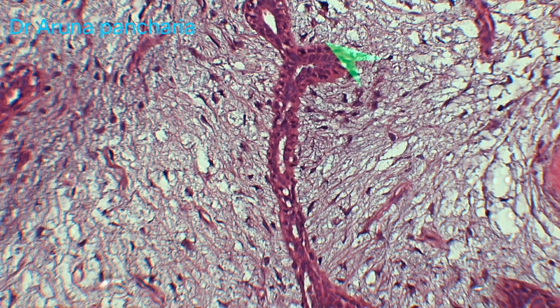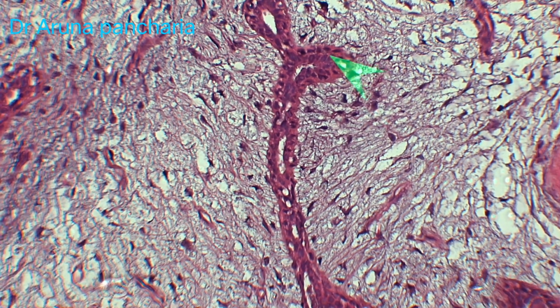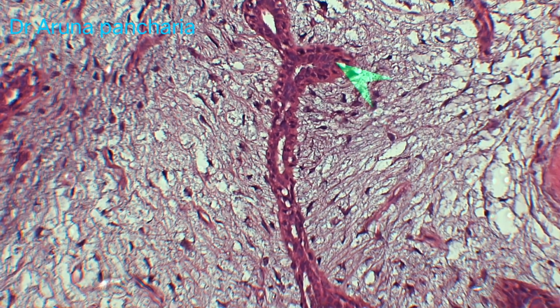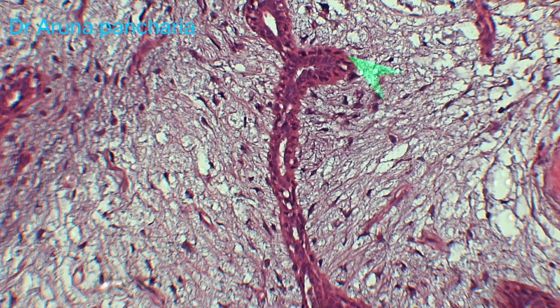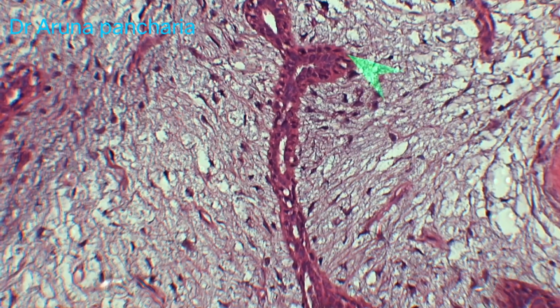Outside there is a myoepithelial layer, which is horizontal, and the vertical layer is low columnar to cuboidal epithelium, and the nucleus is round to oval. So these two layers are preserved. So you have to see it under the high power.